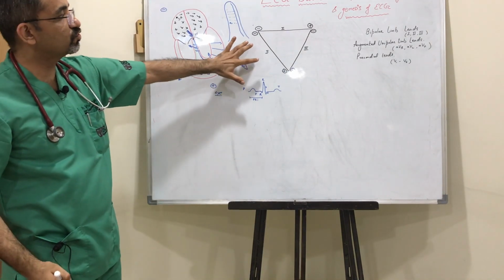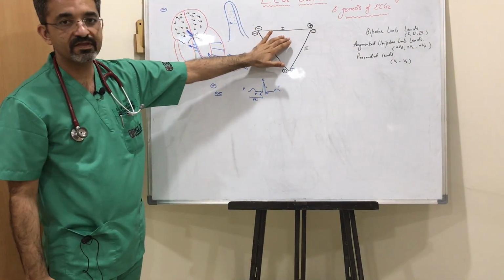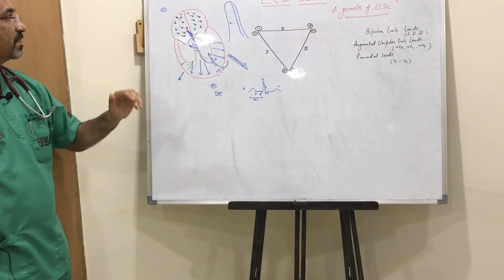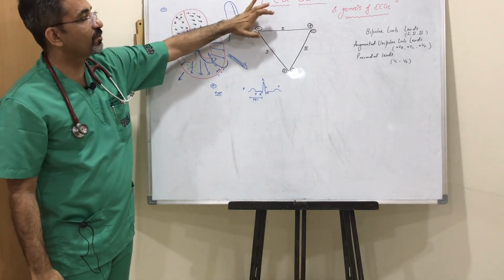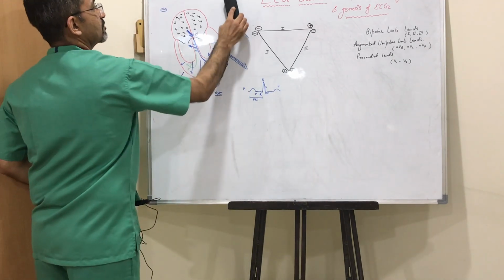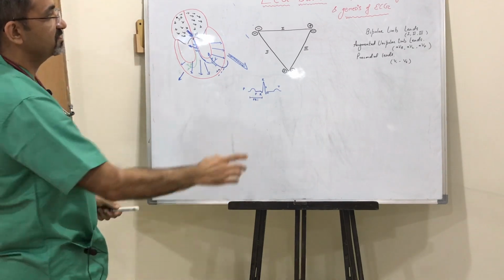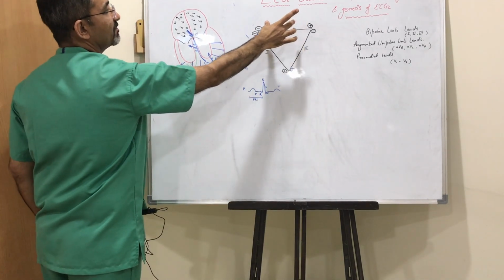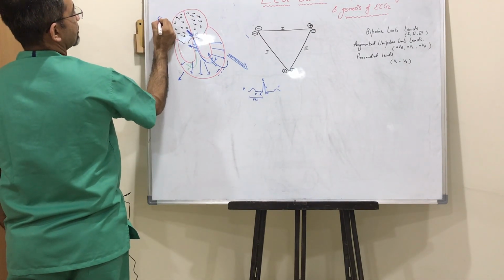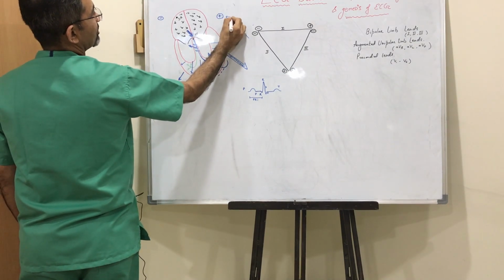See, this is lead 2. Now you have to imagine the same thing happening in lead 1. It's the same thing happening in lead 3. You just have to imagine. See, if I take lead 1, the eye is looking here. If I pull this lead 1 and put it over the heart like this, something is negative here and something is positive here. So my eye is looking here.